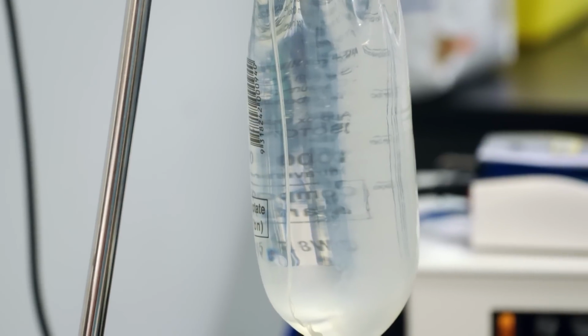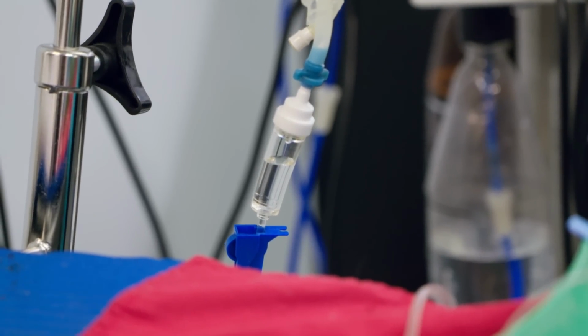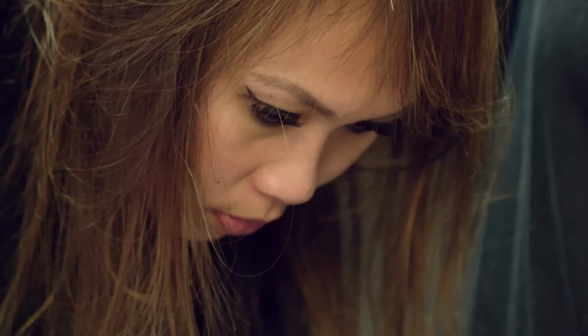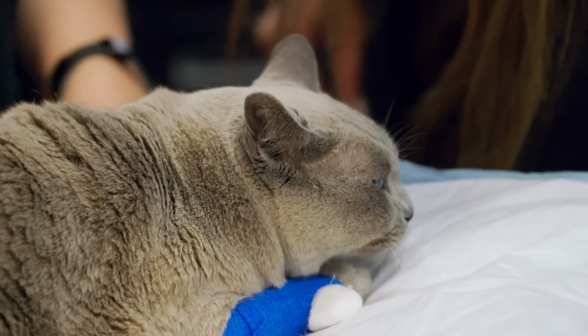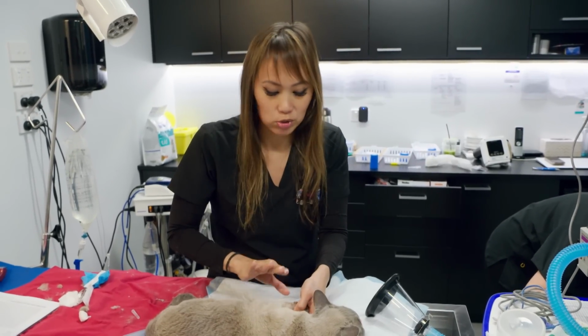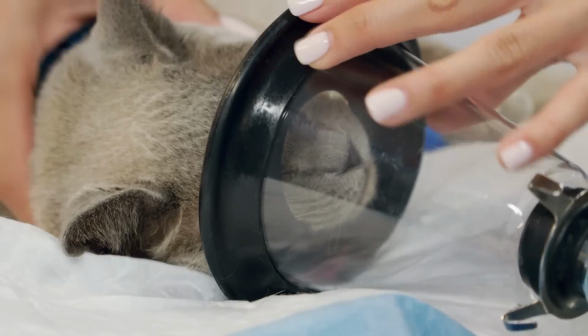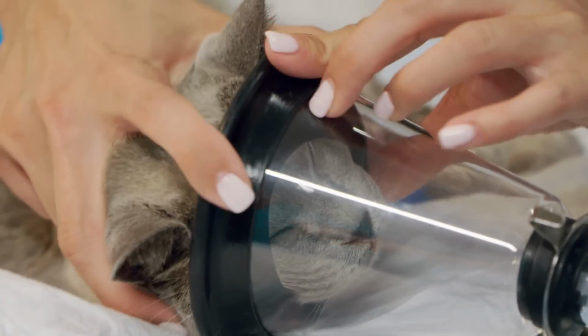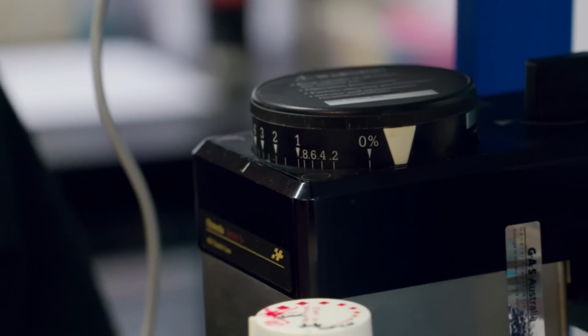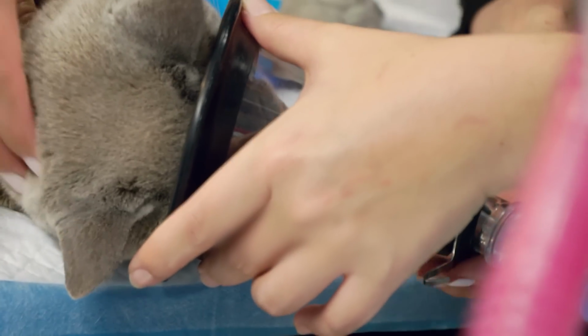So we're going to go really slowly with her anaesthetic. I only want to give her enough so that she just goes to sleep. We've just got to be careful with those kidneys. All right. No, we found the vein, so I've just given it through the needle. What we're finding is her veins collapse with the catheter, so I'm just going to give her some time to go to sleep. So what I'm doing there now is just giving her some gas. Oh gosh, the abscess has just burst with that pressure.